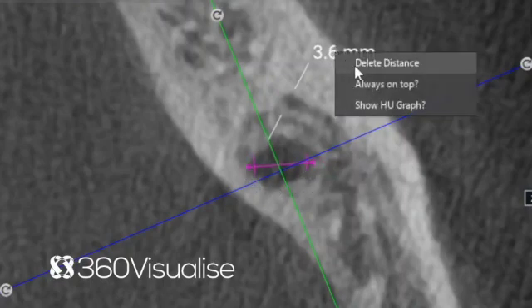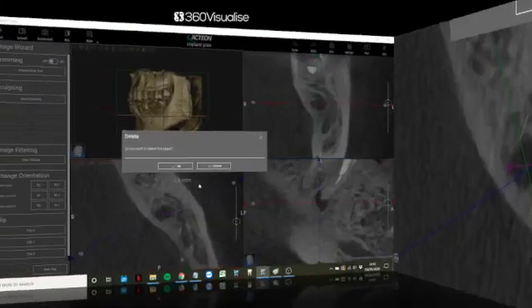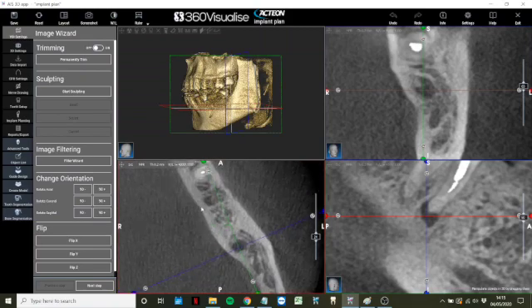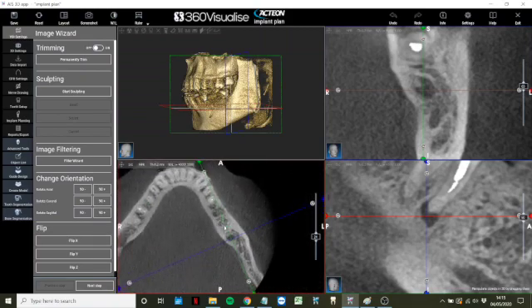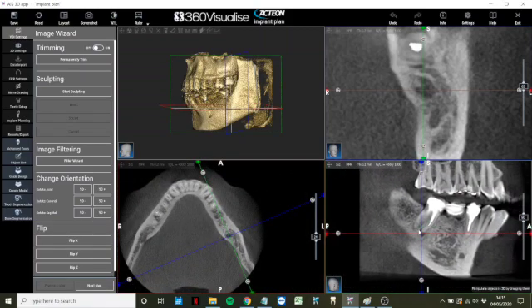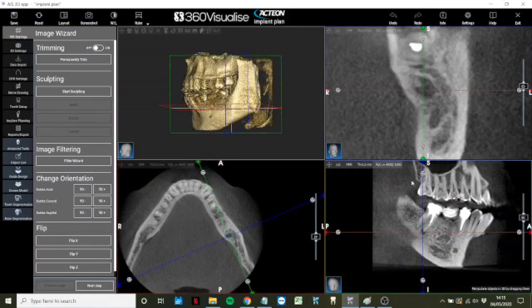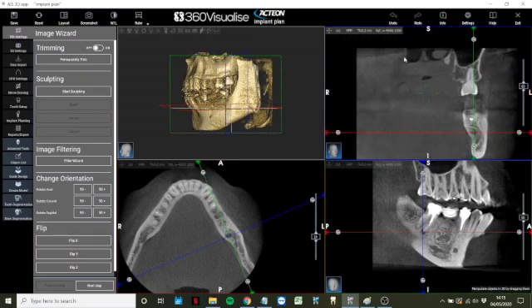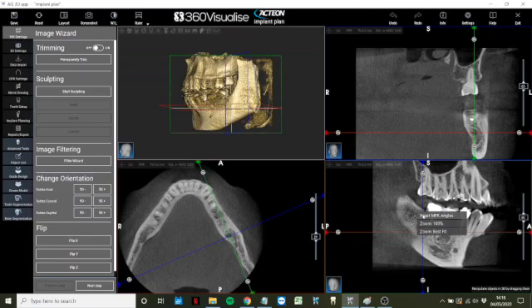We can right click and delete a distance measurement should we wish to. We can also right click to reset MPR angles and last zoom.